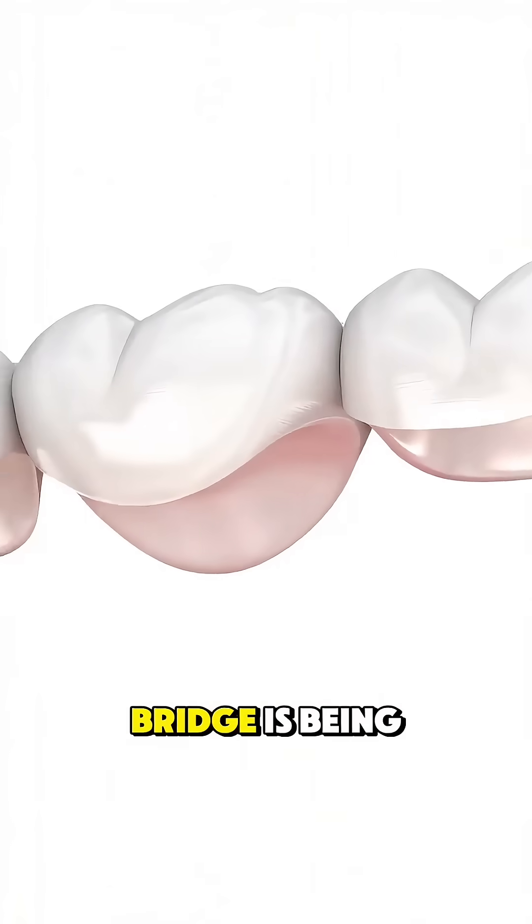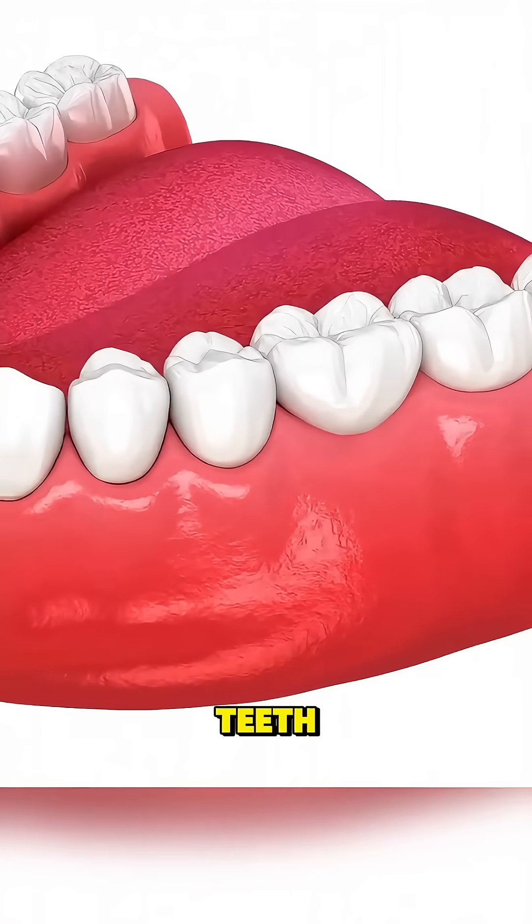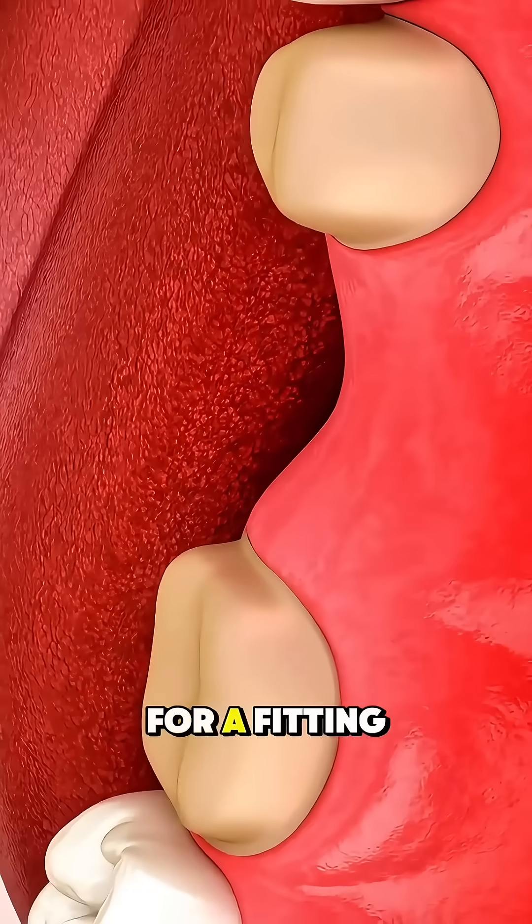While the permanent bridge is being made, a temporary one is placed to protect the shaped teeth. Once the final bridge is ready, you come back for a fitting.